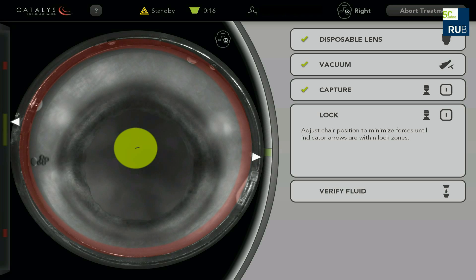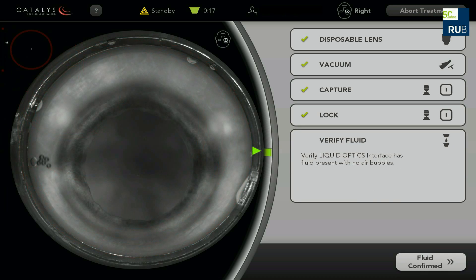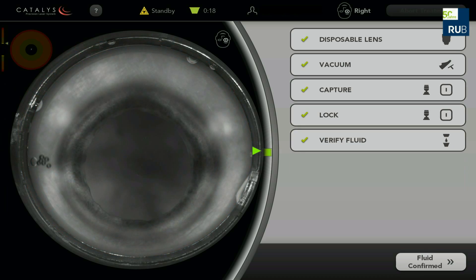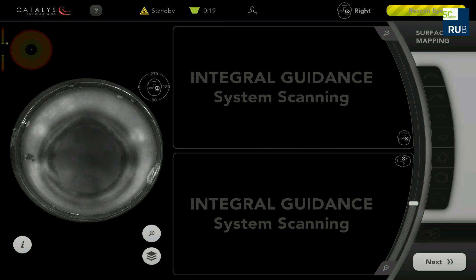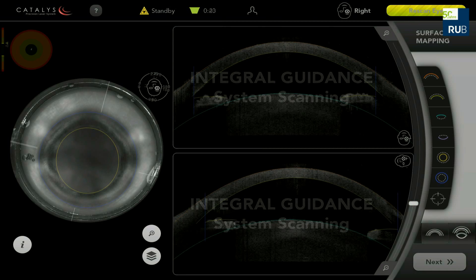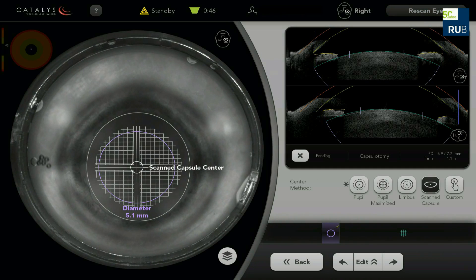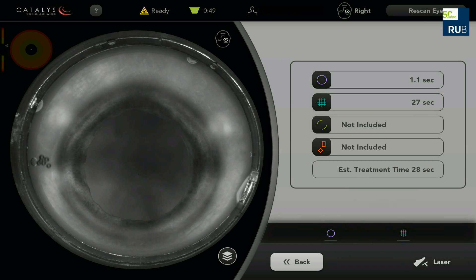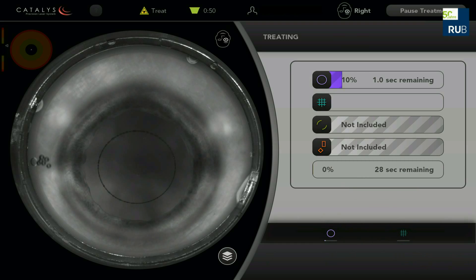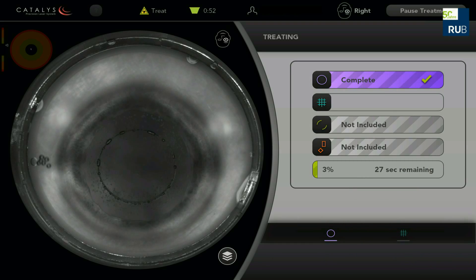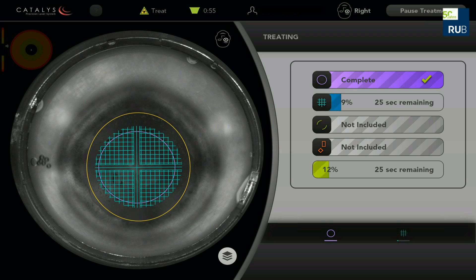This is a case of implantation of the AcuFocus IC8 small aperture intraocular lens using femtosecond laser-assisted cataract surgery. A 5.1 millimeter anterior capsulotomy and lens fragmentation were done using the Catalys Precision Laser System.